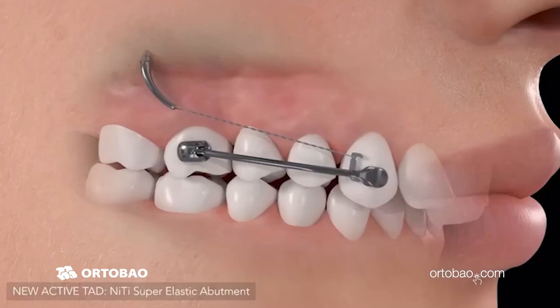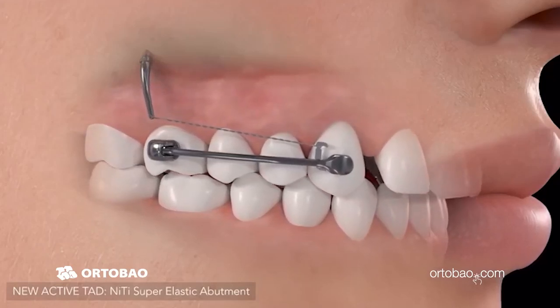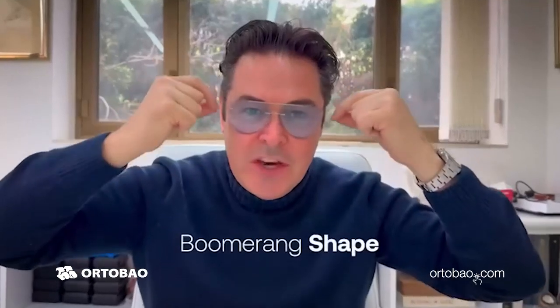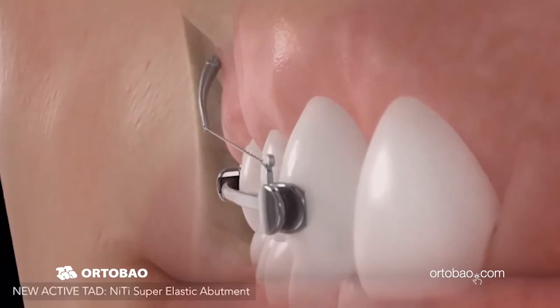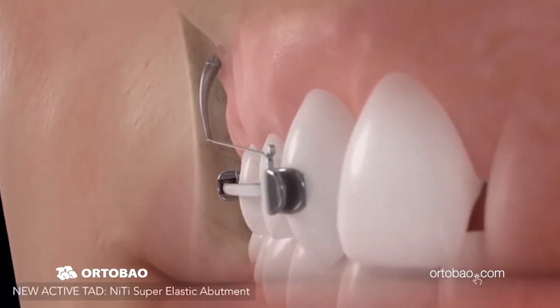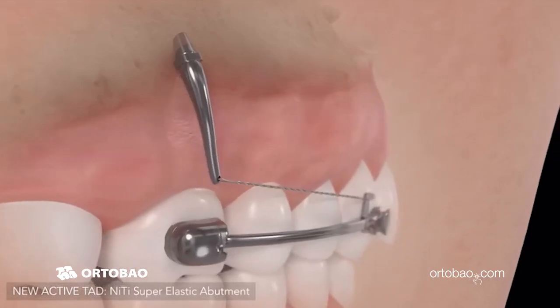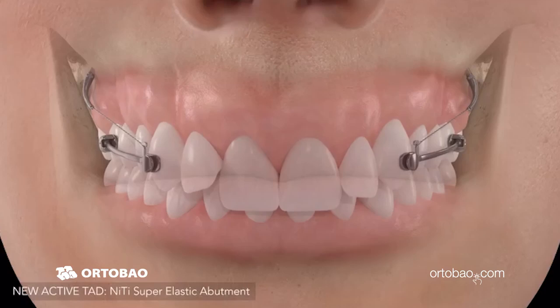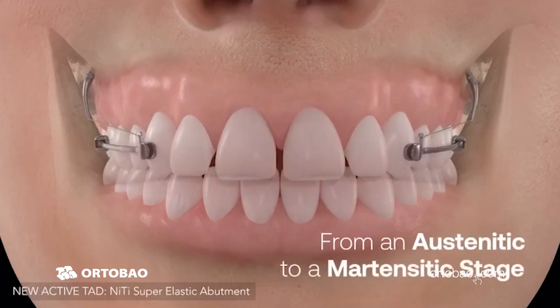For instance, if we want to distalize the posterior segments, we will have a boomerang shape of this active abutment. This will give us the possibility of ligating onto the tooth that we want to distalize, and then when the TAD becomes stiff by means of changing from the austenitic to a martensitic stage, bam, we will have the movement of the posterior segments into distalization.